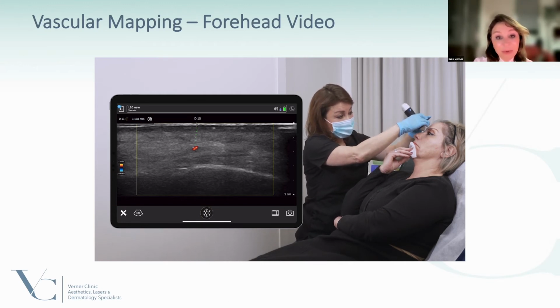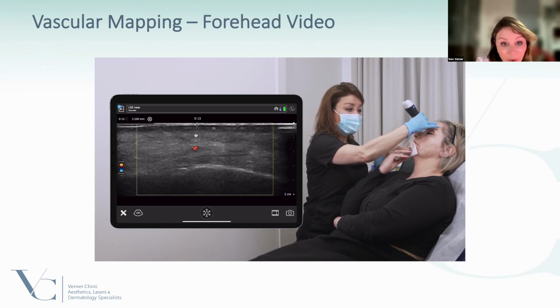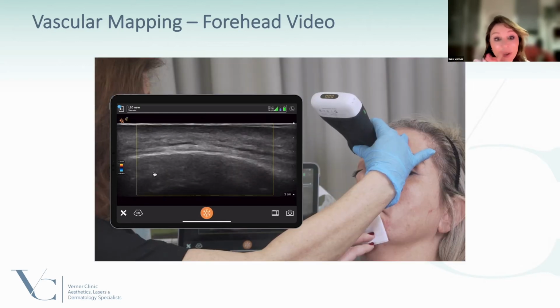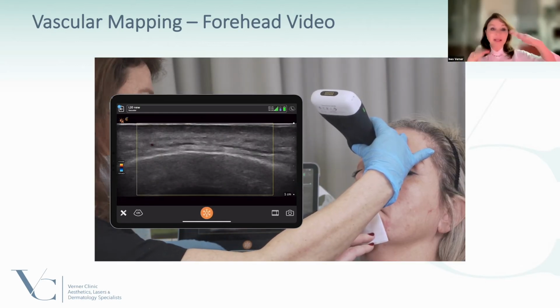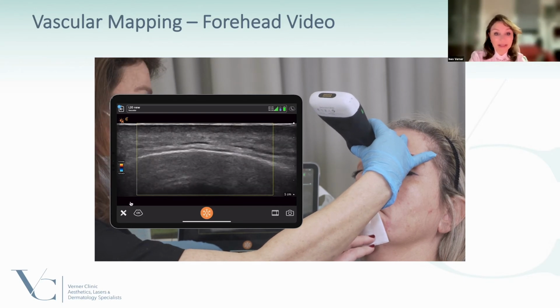So what is here, I think this was the supraorbital artery depth, and I think this was also the foramen there. And actually it's easy. The foramen will be like a break in the bone when you see, because the bone here is the white line, so the foramen is like a break in this continuation of the bone. And now, for instance, in her, we could go on and inject her forehead.